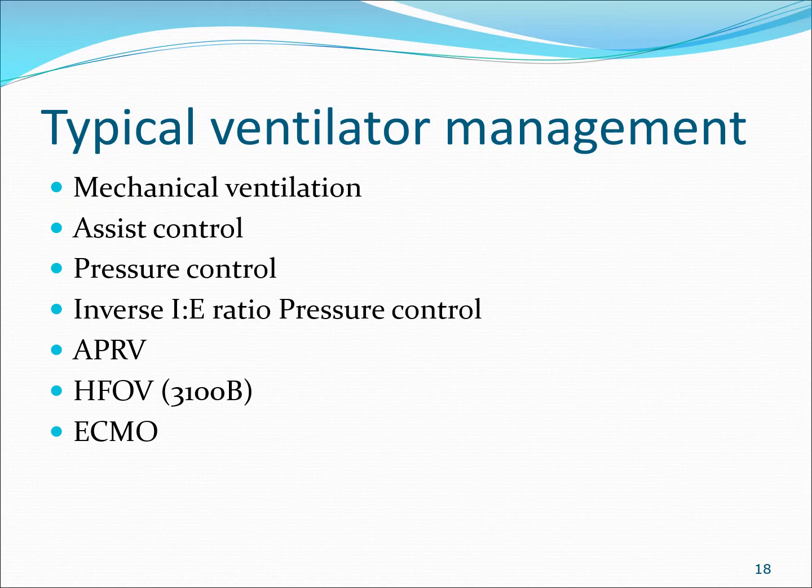So what you want to do, to control the pressures going into the lung, is put them on pressure control ventilation. What this does is limit the amount of pressure to the lung, so as not to cause damage to the lung. The offset to that is, if you keep the pressure lower, you're going to end up getting hypercapnia, because you won't be able to blow off all the CO2. And eventually your oxygenation status goes worse.